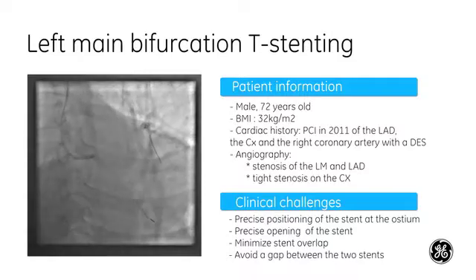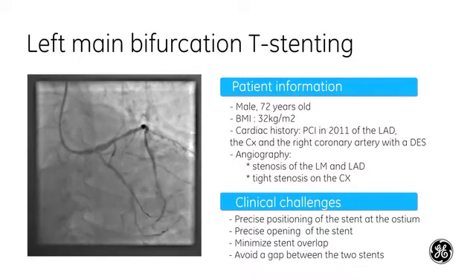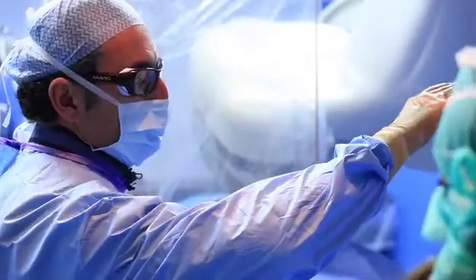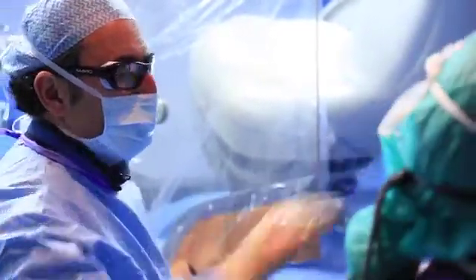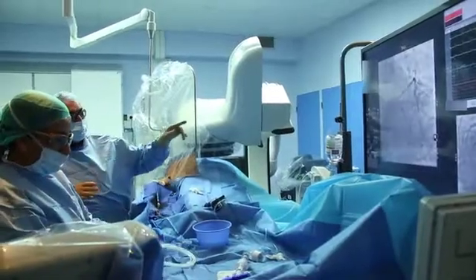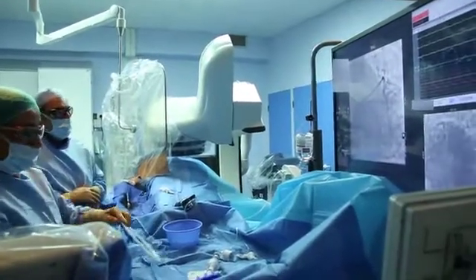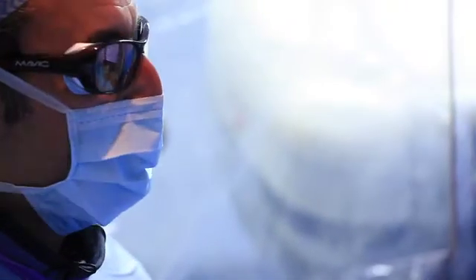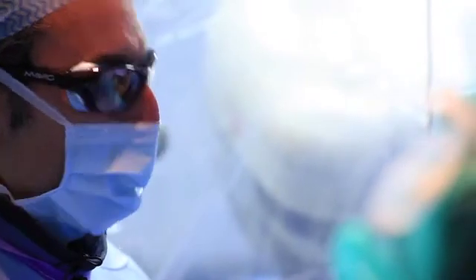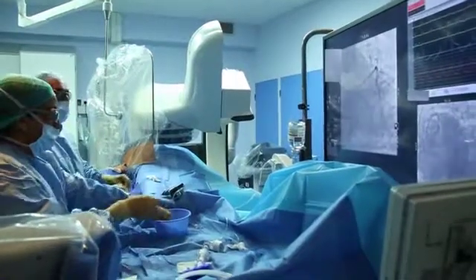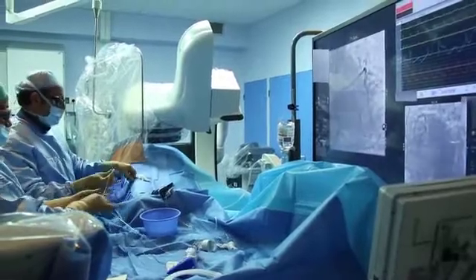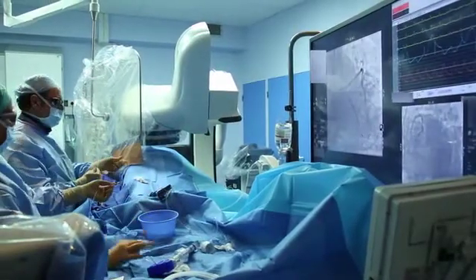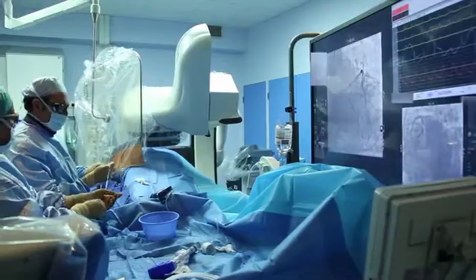What is your strategy? So the strategy will be to stent the left main and going to the LAD with a jail wire on the circumflex, and then we will open the strut of the circumflex and change the wire before. So let's go to stenting of the LAD and the left main.